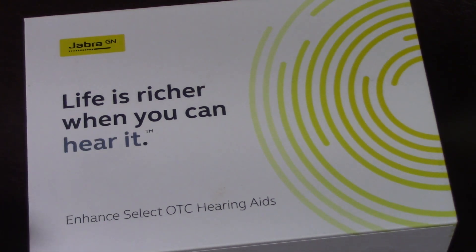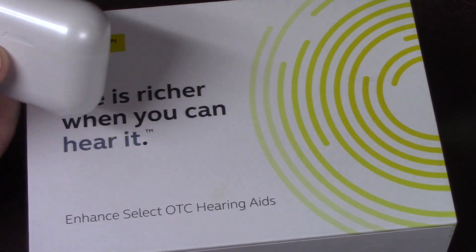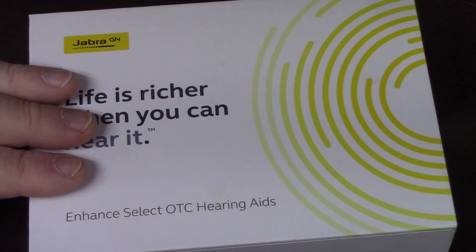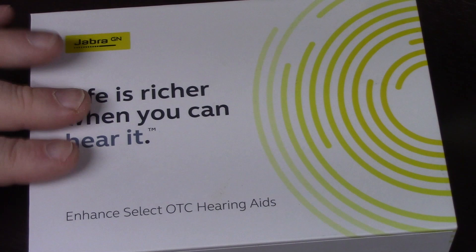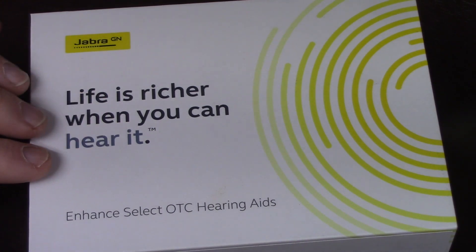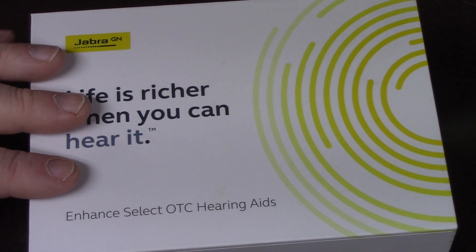So why did I jump up to these? I didn't hate the previous ones. They were in-ear, and I didn't particularly care for in-ear. A couple things I wanted to make sure I got in my next set: Bluetooth was a biggie, and some kind of noise canceling - although most of these do some type of noise canceling.